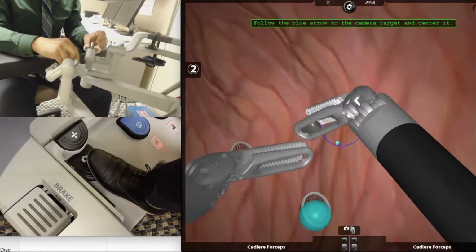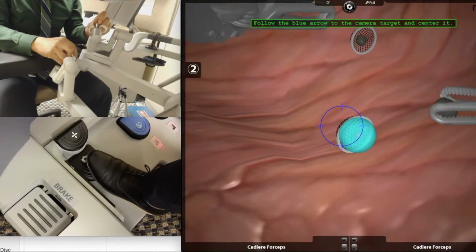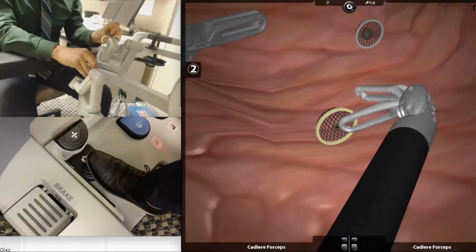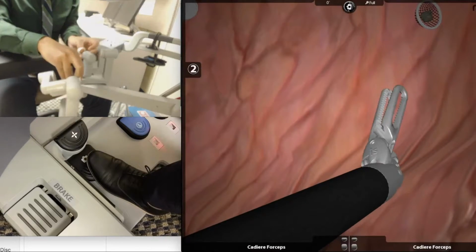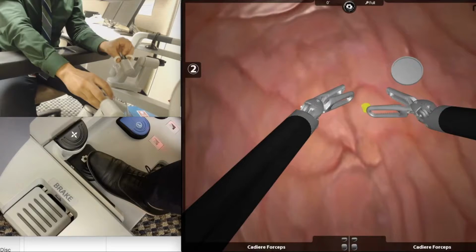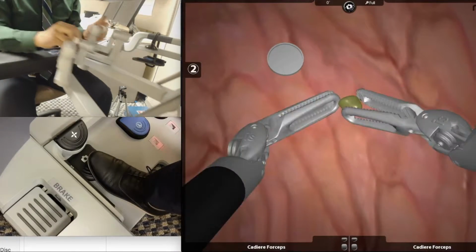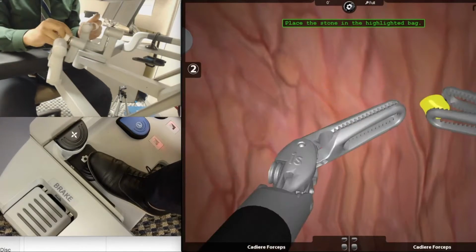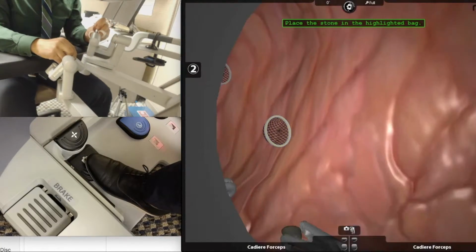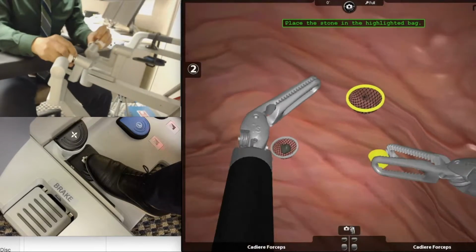If you are off horizon more than 90 degrees, in particular for the last target, your object will most likely fall away from the basket. In that case, you'll have to retrieve the object, adding to your time to complete the exercise. So especially for the last target, you must make sure your camera is in horizon.